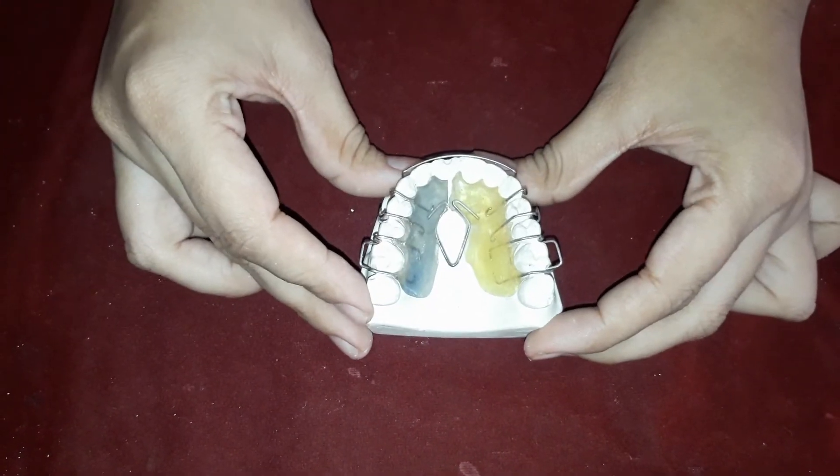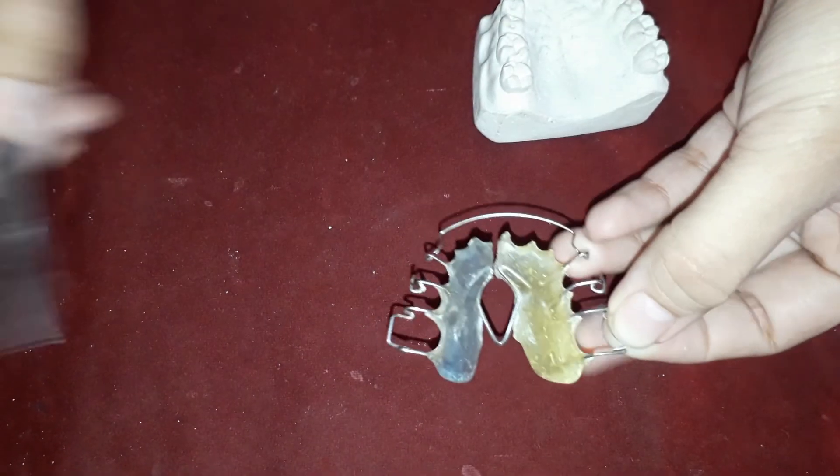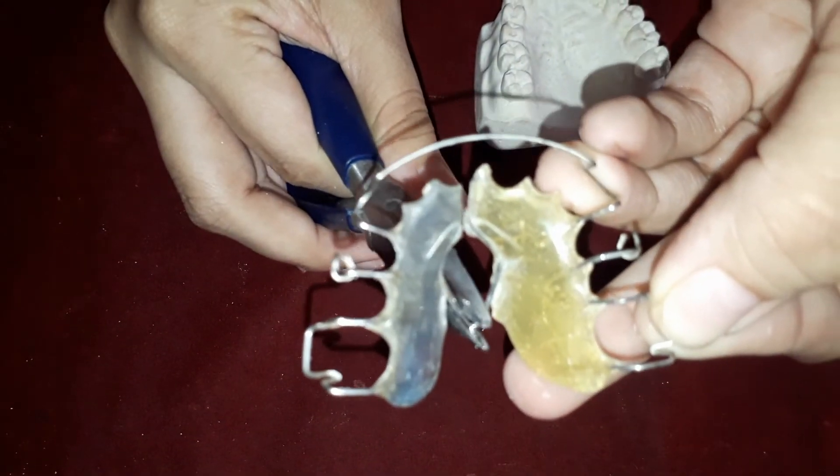Coffin spring activation is very easy. It's just by opening the V-shaped region with the help of universal plier.